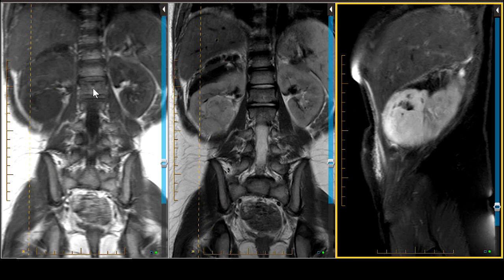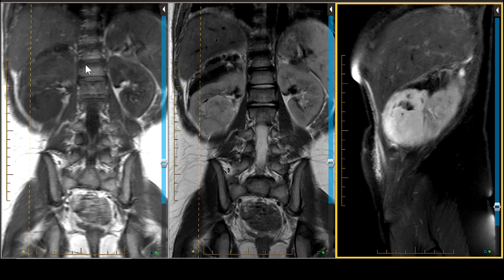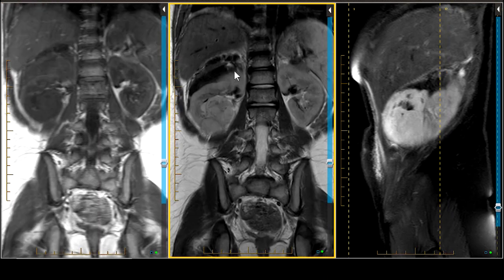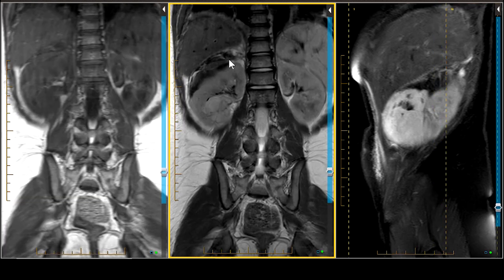In a five-year-old, what would you think of? Under age 10, you really have to think about Wilms tumor — a renal tumor we'll discuss shortly in terms of demographics. But the most important differential diagnostic consideration in a patient five years of age or younger would be neuroblastoma. Both neuroblastoma and Wilms tumor occur in young individuals under age 10 — neuroblastoma around age 2. Since neuroblastoma arises from the adrenal gland, the fact that our mass is centered below without a shape reminiscent of an adrenal lesion favors Wilms tumor.